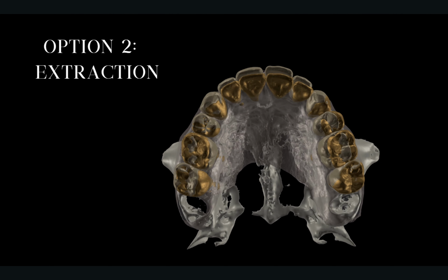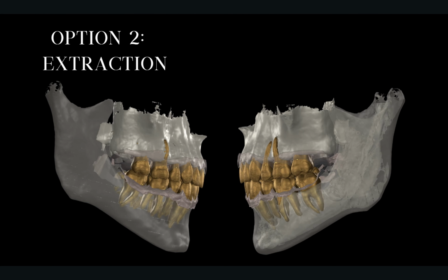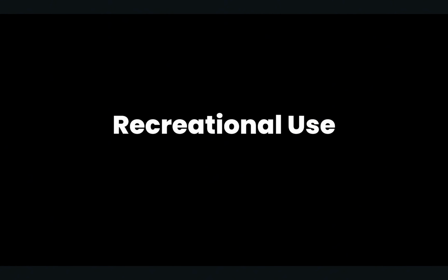Or, for example, you can show a patient, why am I suggesting to extract your wisdom teeth and sequentially distalize your teeth orthodontically? Why is it a case that if we don't make space in a certain way, we're not going to be able to achieve an outcome for you? Showing that the movements that you want me to do are probably not a good idea because I'm going to be busting roots out of the bone, and that's not good for anyone involved.